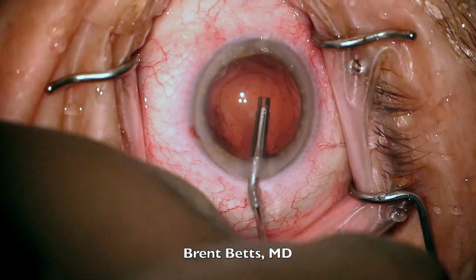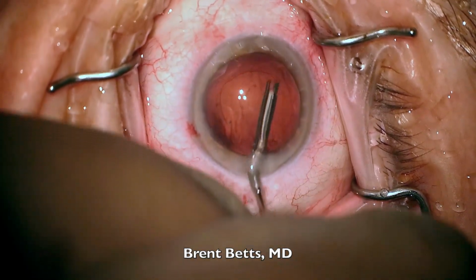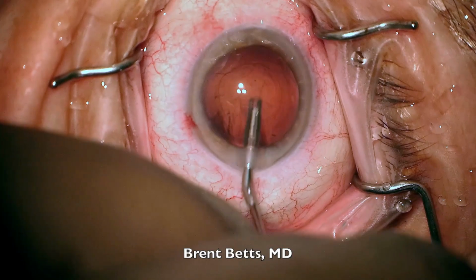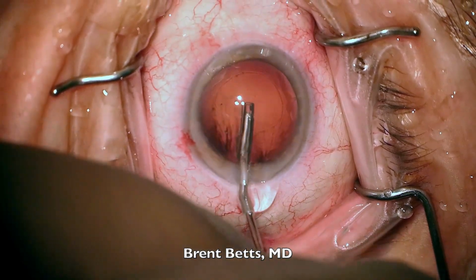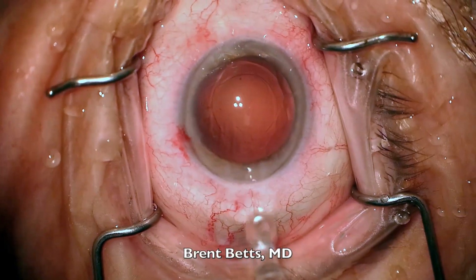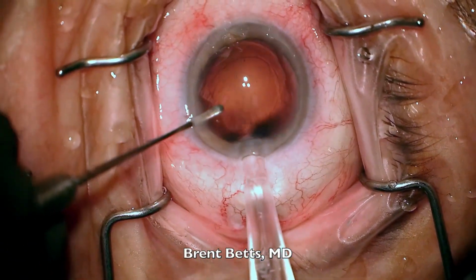I also use a device called a Terry squeegee, which is a silicone tube attached to a cannula. There's an additional type of viscoelastic here, so I slowly inject the viscoelastic and polish the posterior capsule. This aids with improvement in visual acuity after surgery and also minimizes the risk for scarring on the back of the posterior capsule, which is a common finding after cataract surgery.